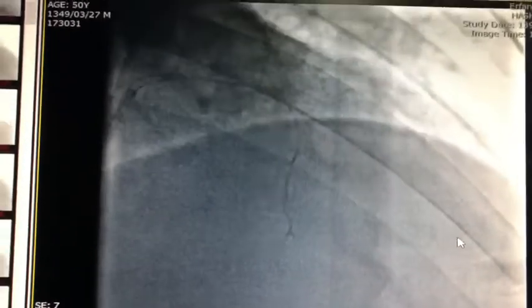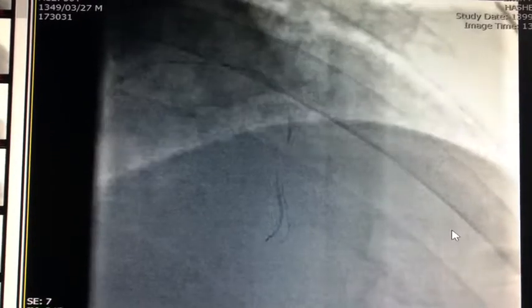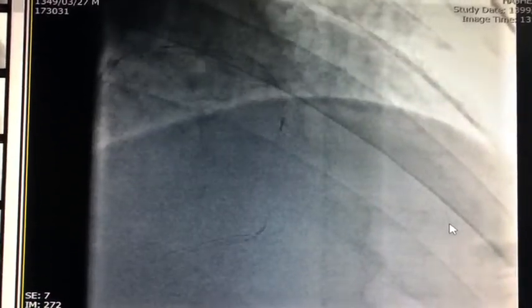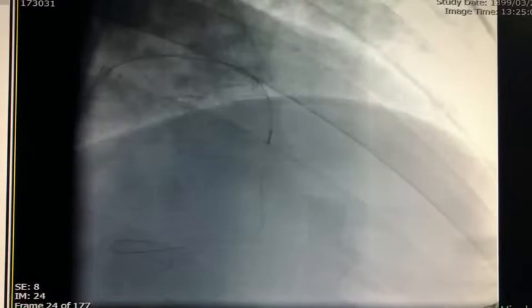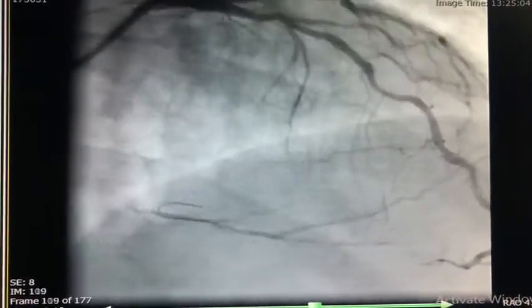So I will let the slide run for a little bit, and you can see how easily the SUOH 03 passes the retrograde septal. And then after confirmation with injection that we are in a good position, we may try to pass the Caravel through.